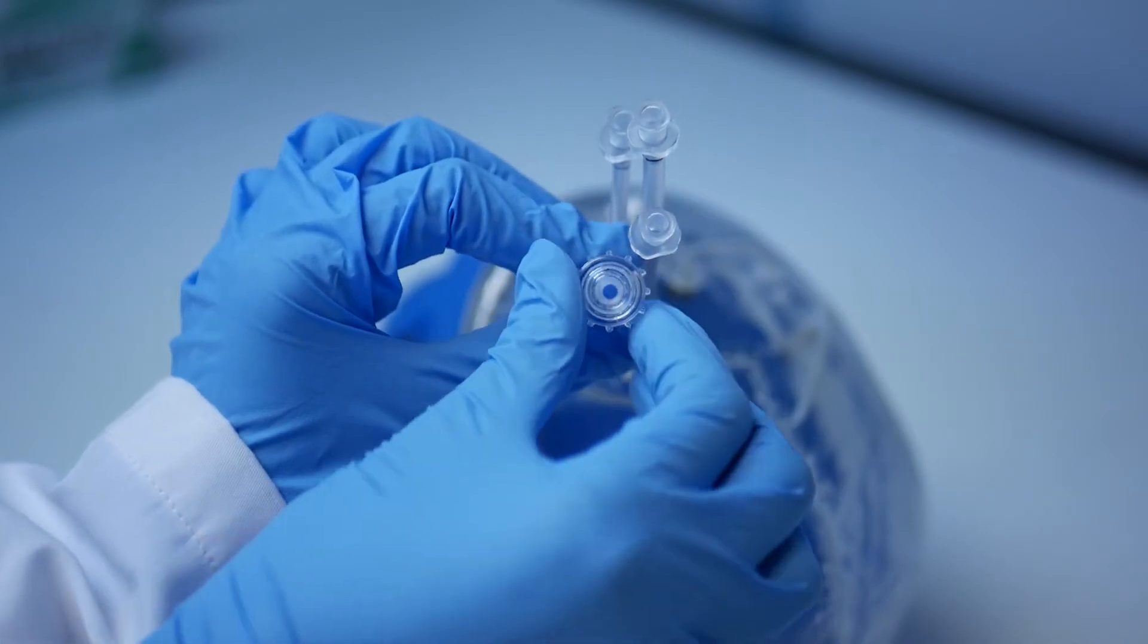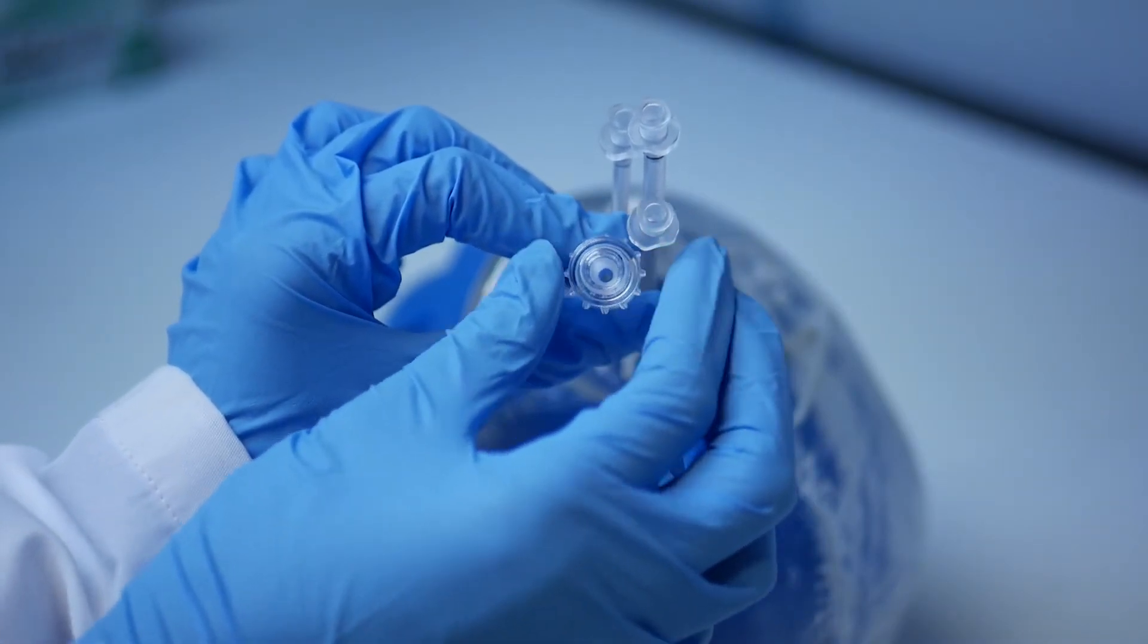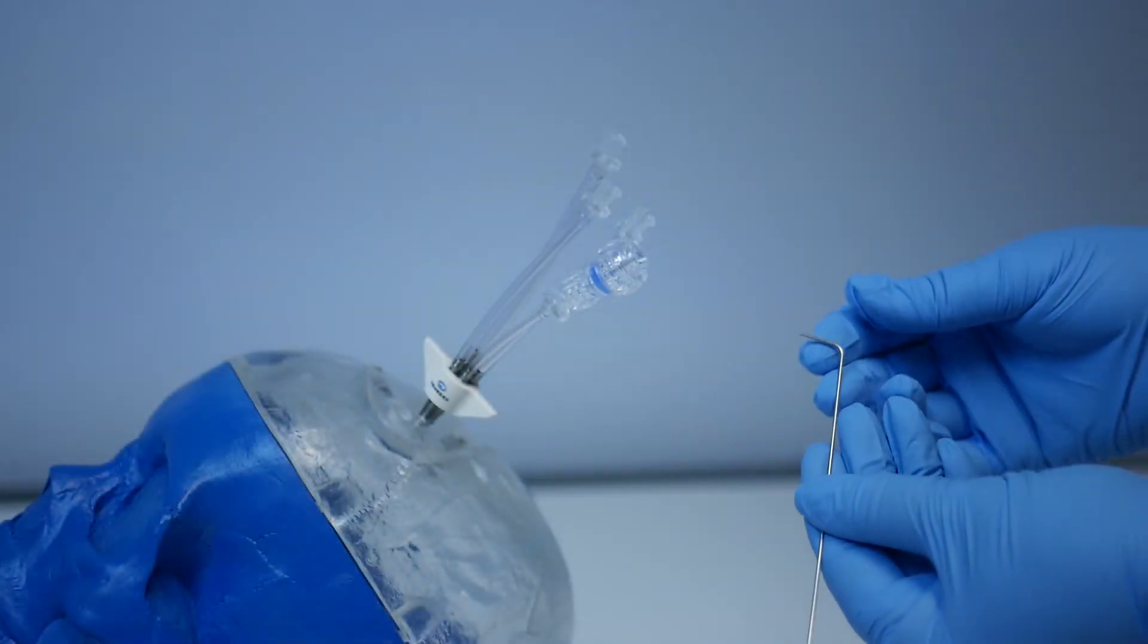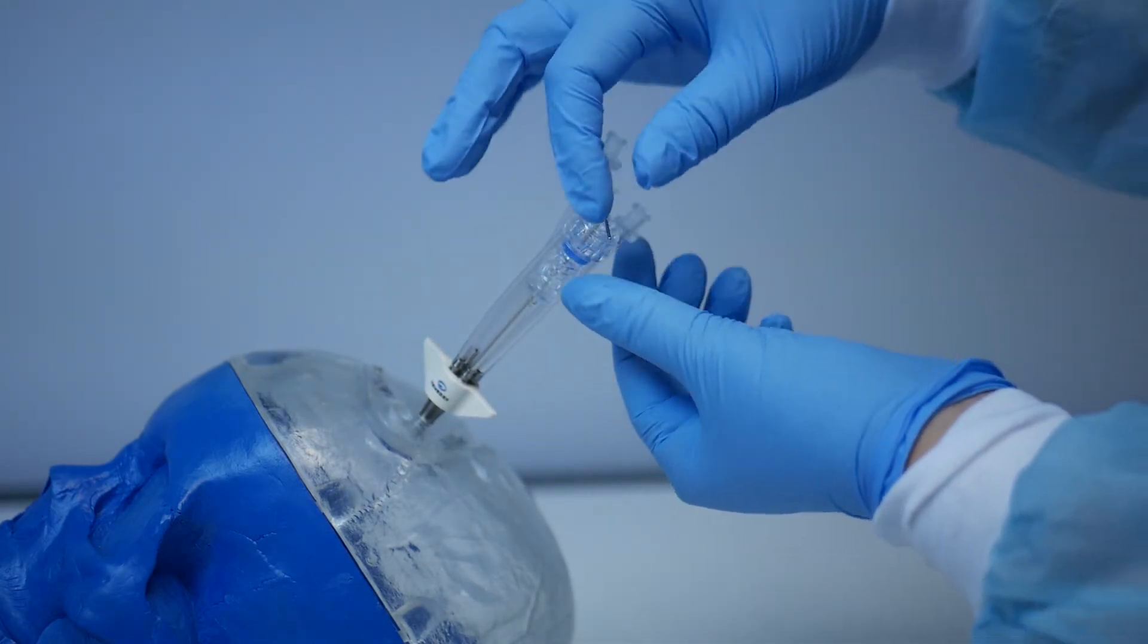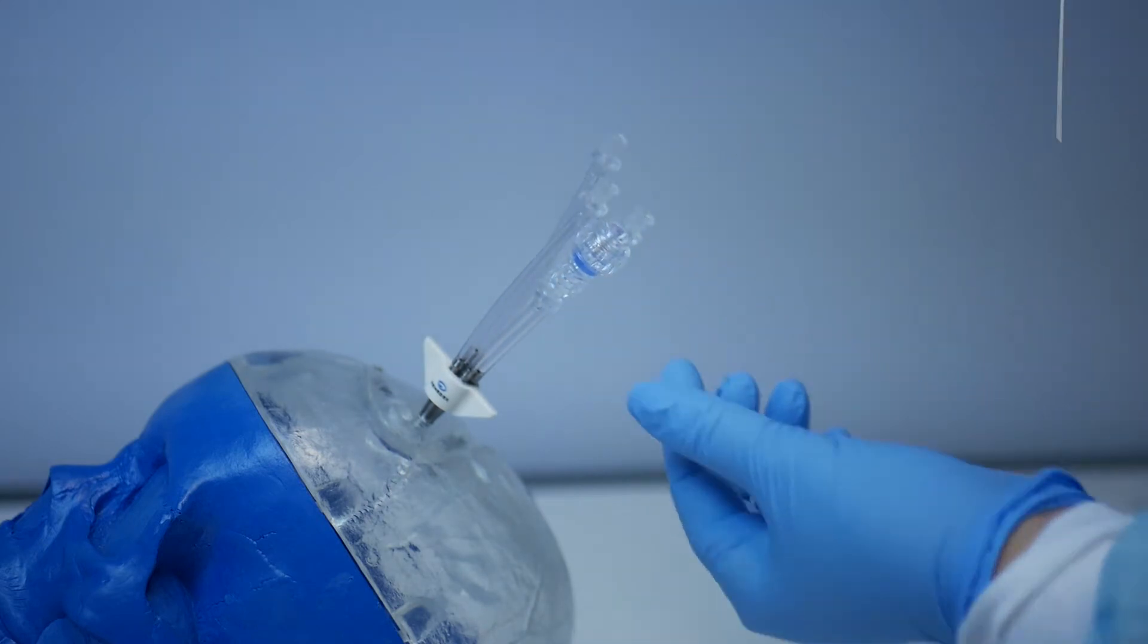Open the compression fitting on the short pigtail. Take the Durapiercer that you set aside earlier and insert it through the compression fitting on the short pigtail of the quadlumen bolt. Remove the Durapiercer after piercing the dura.